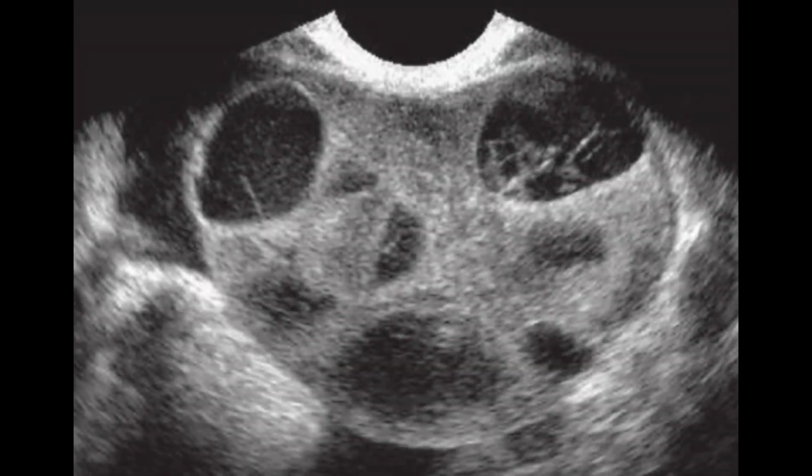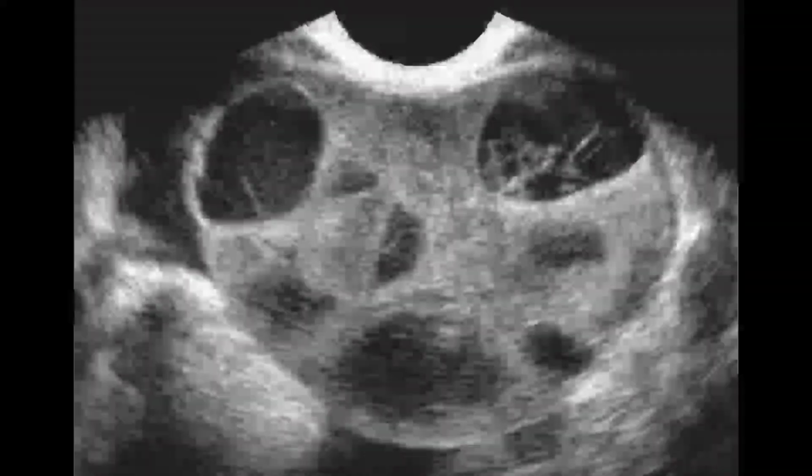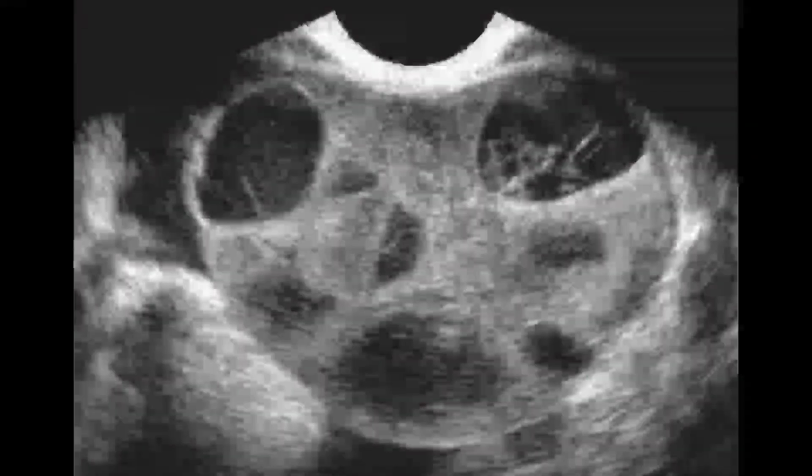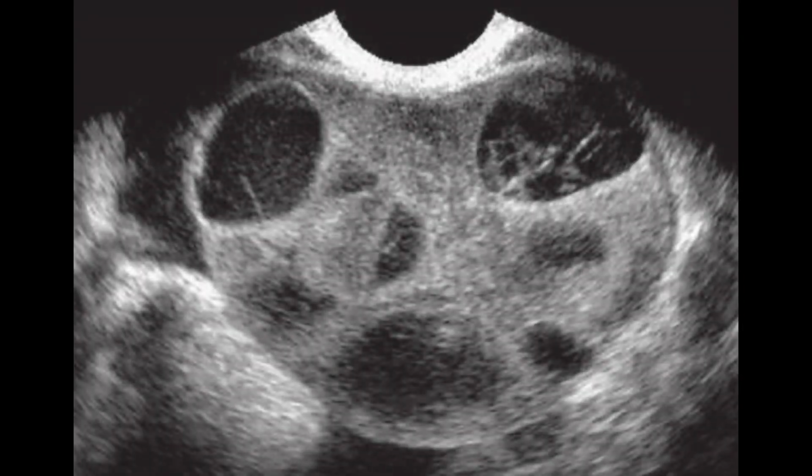Besides this, multiple follicles can be seen in the ovary, some of them having a low level internal echo, which suggests hemorrhagic contents, and some of them having a fine granulation or reticular pattern. Some of them have small or thin septations. Serum HCG level was increased, and besides this you can see edematous status of the ovary as well. So ovaries are enlarged, multiple follicular cysts are there, some of them are hemorrhagic cysts. So this is a classical example of ovarian hyperstimulation syndrome.